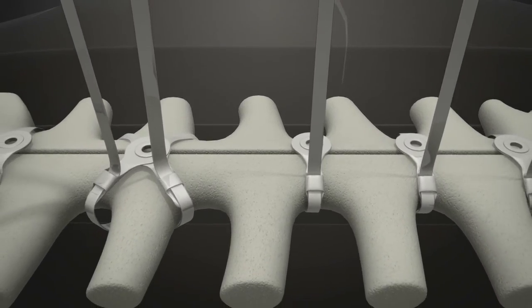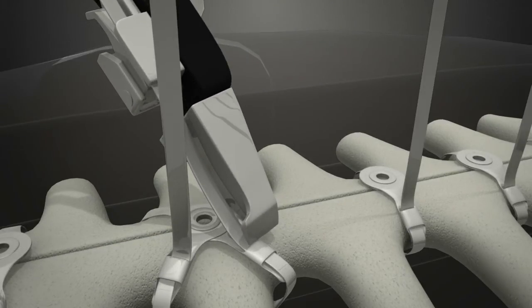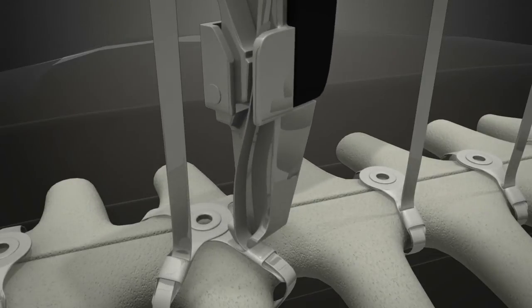Once all straps have been tightened, return to the initial central sternal strap and tighten until fully approximated, then bend to 90 degrees.